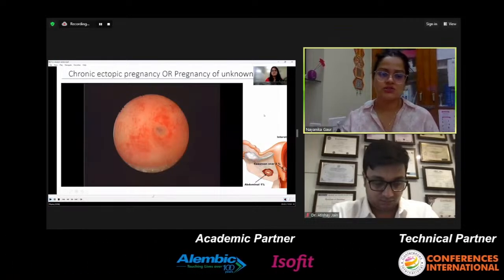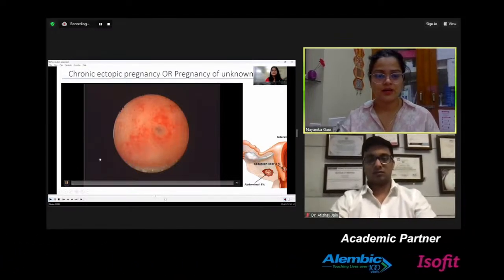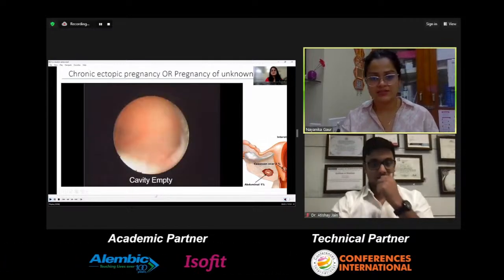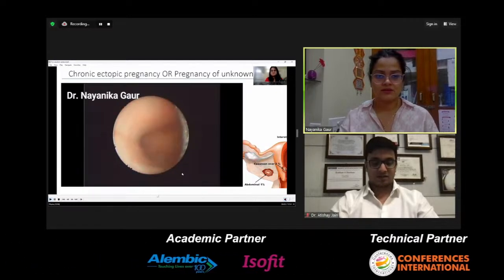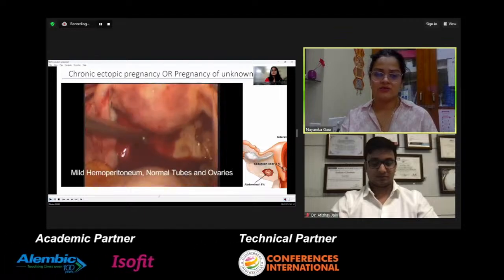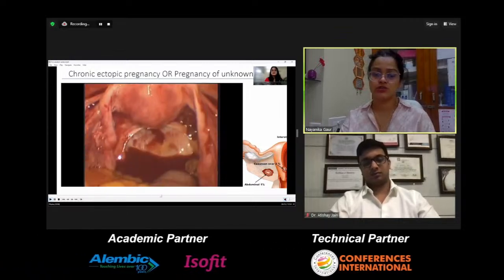So, this is the hysteroscopic view of this patient, wherein we were able to see the ostia. The cavity looked clean and technically not pregnant. An empty cavity was identified here. And as we went in with the laparoscope, we saw that there was some amount of hemoperitoneum. The tubes and ovaries grossly looked normal.